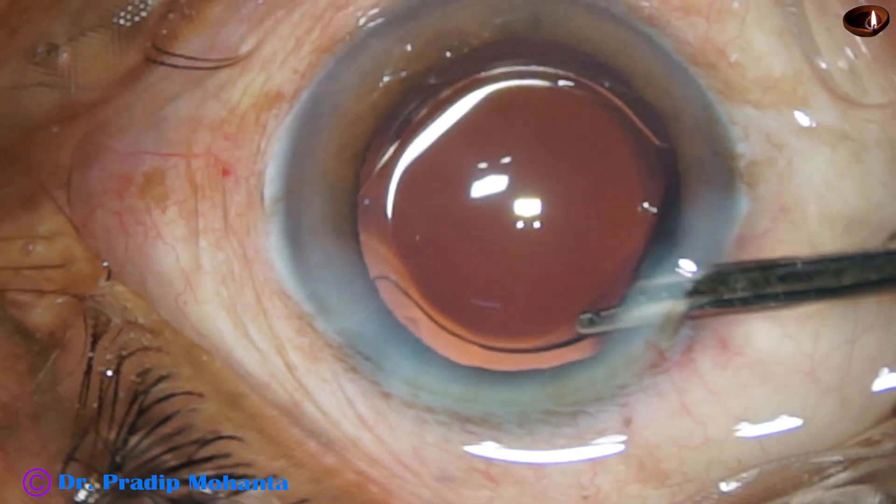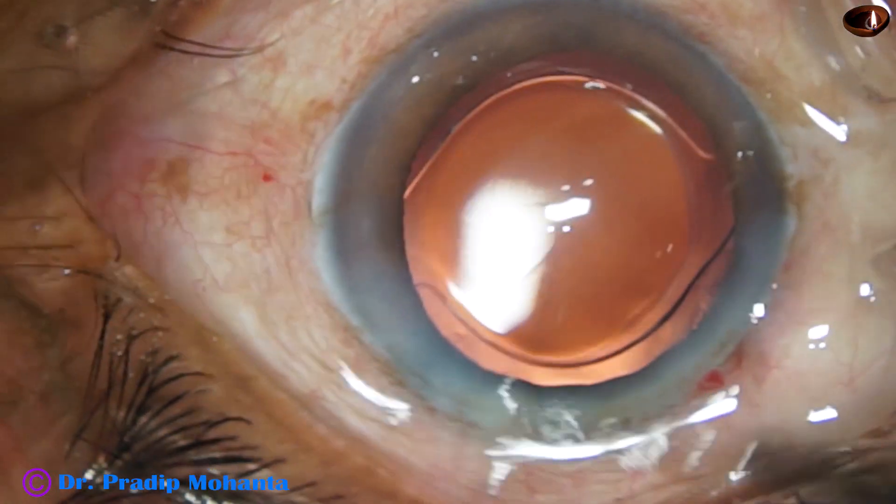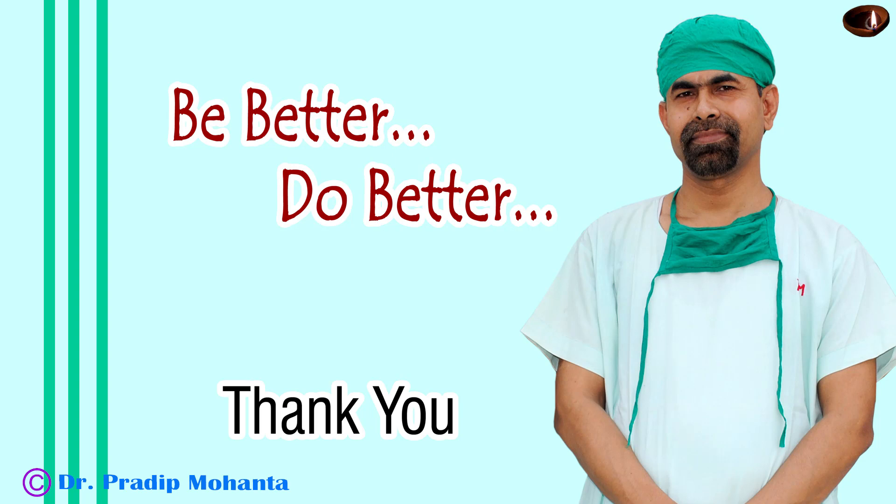This is the final lavage of the anterior chamber. The anterior chamber is formed and the case is concluded. Thank you very much for your attention. I hope this video will help you in developing your surgical skills. Be a great surgeon and serve your patients with love, respect, empathy, and great surgical competence.